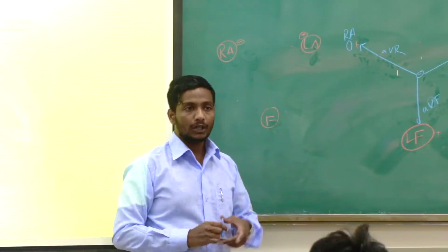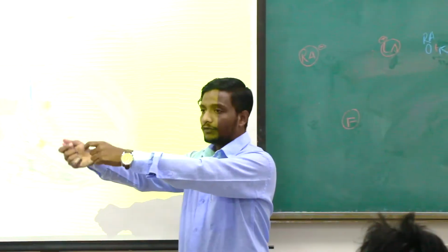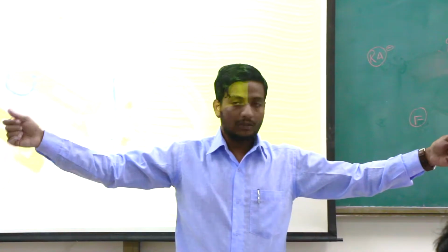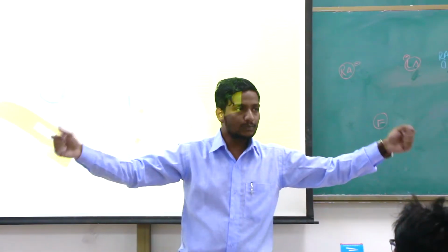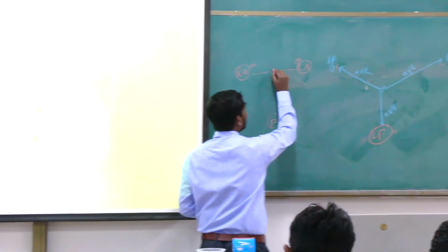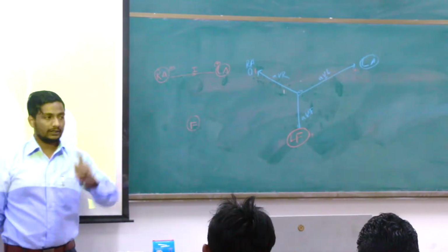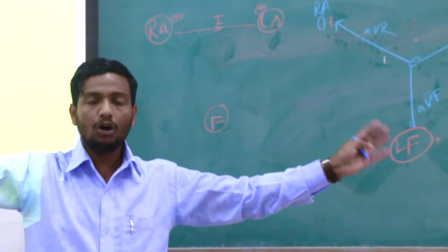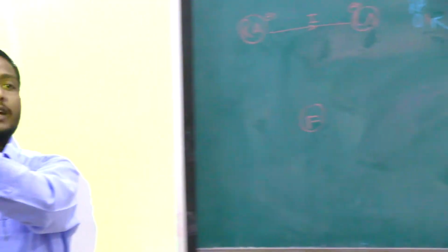Okay, you people tell me, for this particular electrode, which is going from the right arm to the left arm, you tell me what will be the axis? Right arm to the left, because it has to go from negative to positive. Clear to you? Yes, sir. Okay, so this is going to be the first lead. And this one has been given one name, what do you call it? Lead 1. Right? So lead 1 goes from the right arm to the left arm. And this is already fixed in the ECG machine. That this one, when they are going to work in combination, it will be working as negative and this will be working as positive.